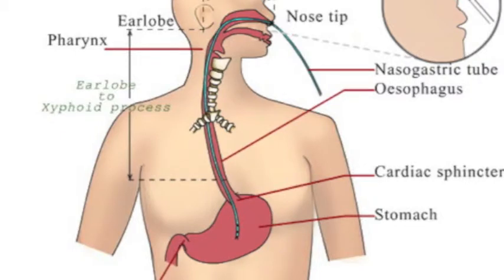Generally, as they're walking, you would then clamp the tube and walk them. This is not the proper anti-reflux valve, but it's a connection. It's far better than crimping this and putting it in your tube.